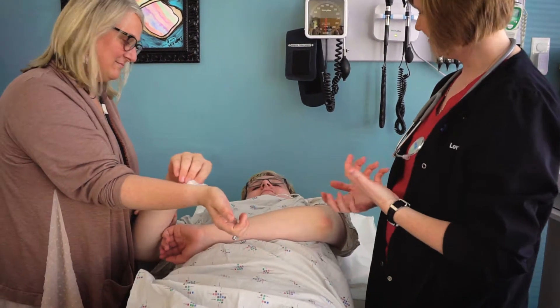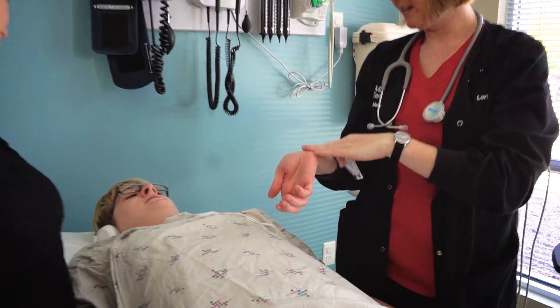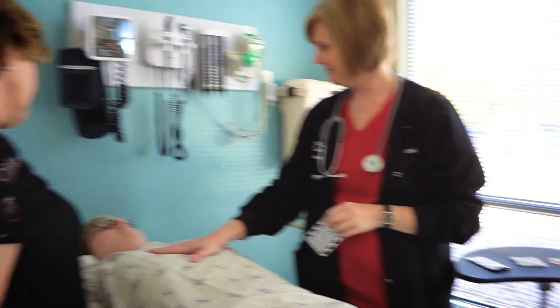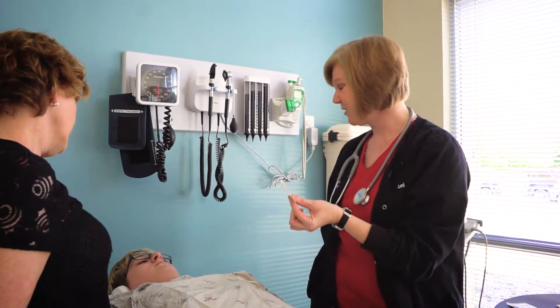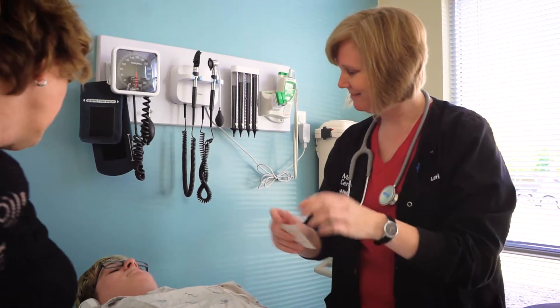After you introduce yourself to the patient, explain that you are going to do an EKG. If the patient has never had an EKG, offer an explanation of the procedure in the best way that matches their communication style. For some, this may be written formats, pictures, or visual models. It is always best to identify the patient's communication style so that your explanation will match.